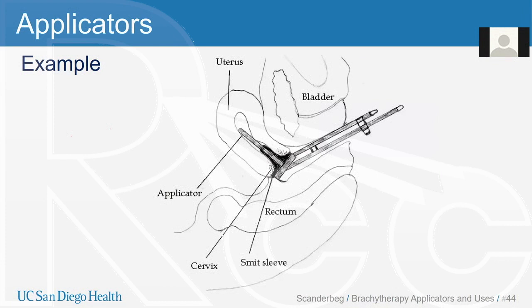Although most would look at this and say it's not nearly as complicated as the implant depicted on the previous slide, there's still a huge potential for mistake shown here. So this is just your simple tandem and ring applicator with 2 connections coming out of the patient, with the tandem being more posterior and the ring more anterior. However, if you're unsure on which applicator is which, you just have a 50% chance of connecting it correctly. And you'll get a wildly different dose distribution and medical error if you swap them and treat incorrectly.